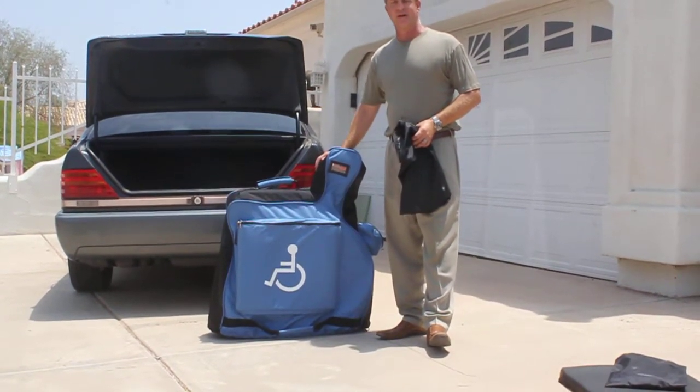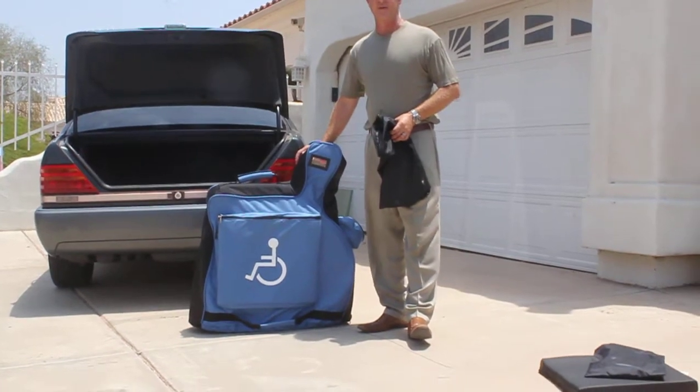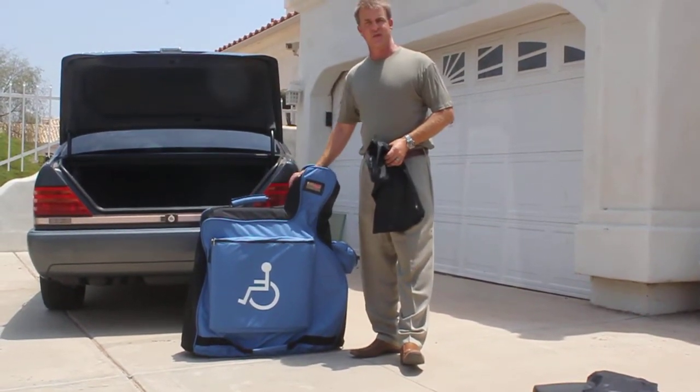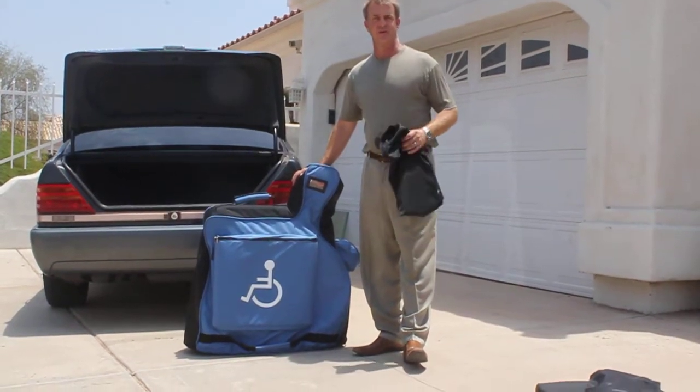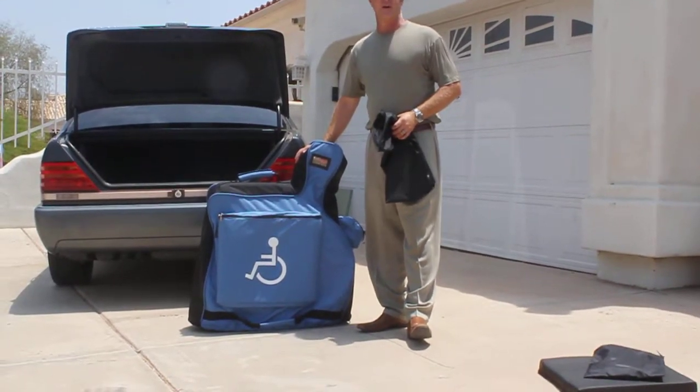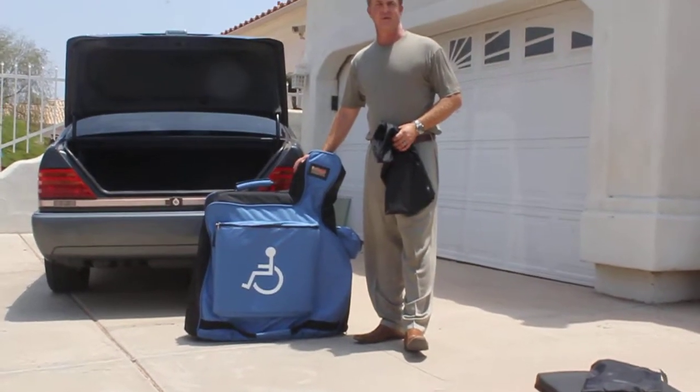You can also roll your wheelchair carrying case — it weighs about two and a half pounds — all the way to the gate. Then the attendants at the airlines will safely secure your leg risers, your wheelchair, and your cushion so that it rides and arrives safely. Right now, the airlines shrink wrap your wheelchair together with cellophane.